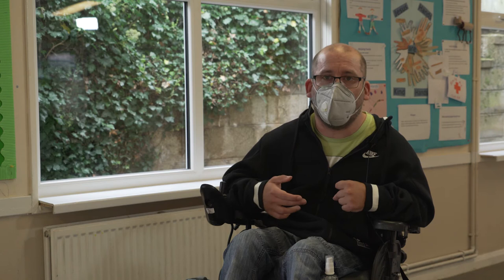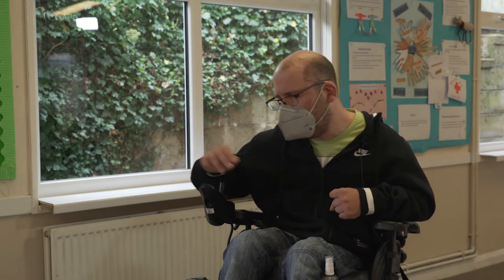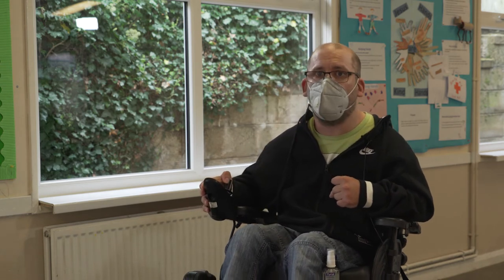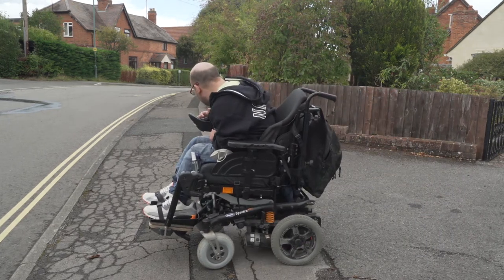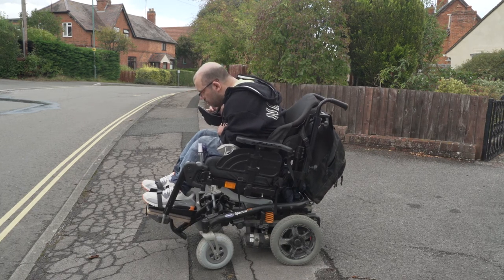What I found when going up and down drop curbs, depending on the gradient and how steep they are, is that sometimes I'll recline my chair back. When I go down a drop curb, I'm still sitting at a normal height — even if you've got a belt on, you can get a bit nervous.